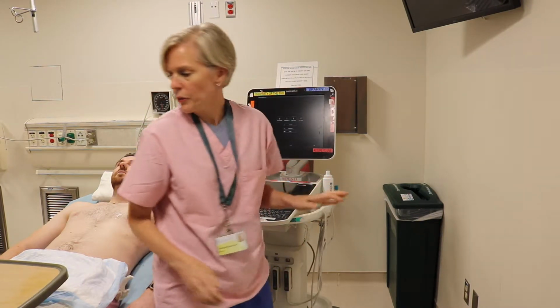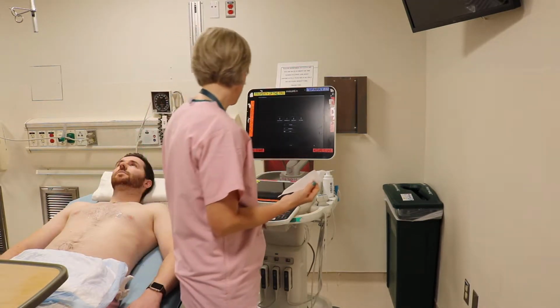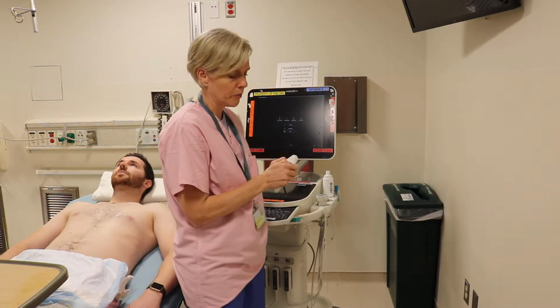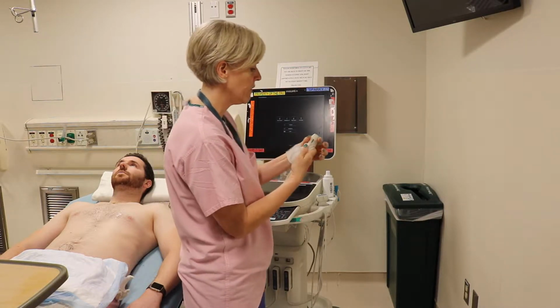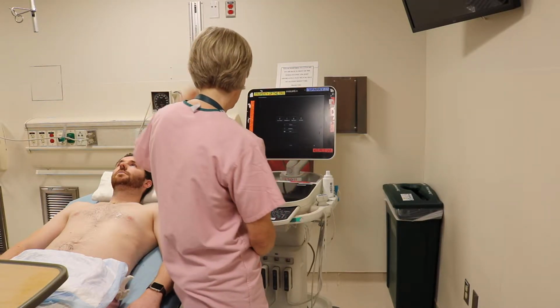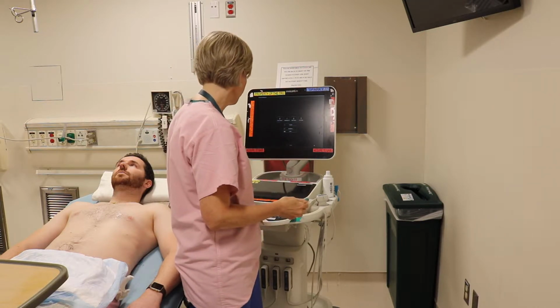Also, you need to make sure that you wipe down each probe before and after every use, because no matter how often we say that, the probes get gummed up and disgusting, and it's just flat out gross. Besides, it's bad for infection control. So wipe down each probe before and after each use.